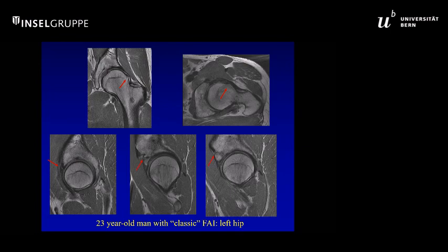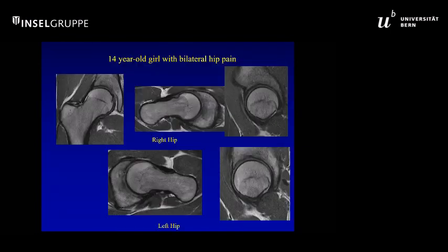Women, however, can be much more subtle, and I'm just going to put it out there because often in the female pattern, they don't have the big CAM lesions. They're often much more subtle. What I look for in the female patients is subtle neck notching that can be characteristic of a female pattern of FAI. Note the over bony containment you can see anteriorly as well.